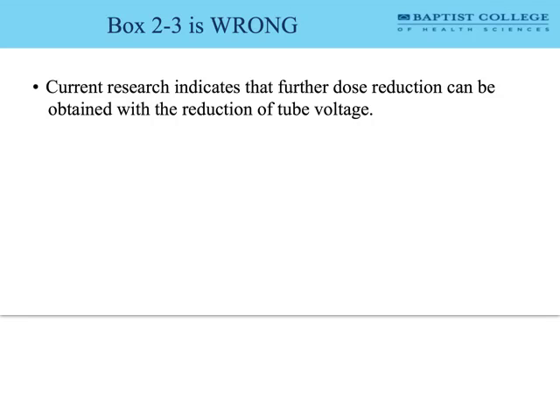In the world of X-ray, increasing the KVP does what to patient dose? It will decrease your patient dose. Interesting, it's one of those weird flipped paradigms where increasing the X-ray power will actually decrease our patient dose. That's a good thing, right? We can still get the pictures we need without exposing the patients to a lot of needless radiation.